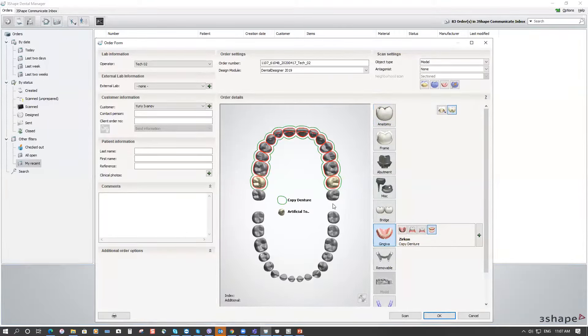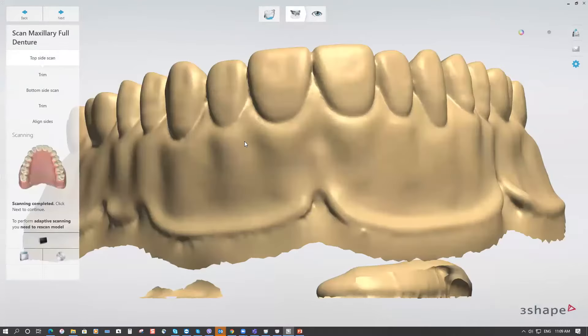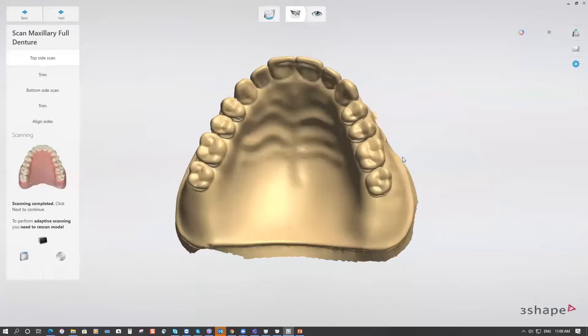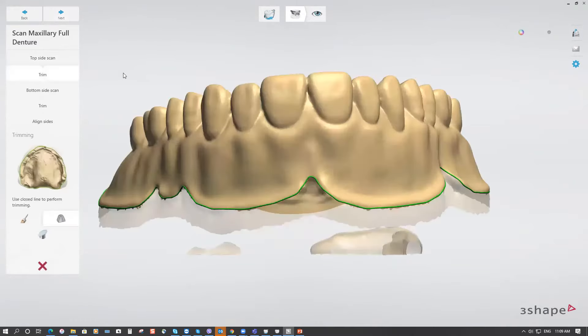This should be done to apply the Copy Denture workflow to scan an existing denture. Click Scan to start scanning. Place the existing denture over the transfer plate — you can use blue tack to hold the denture on top of the plate — and scan the cameo surface, the top of the denture.